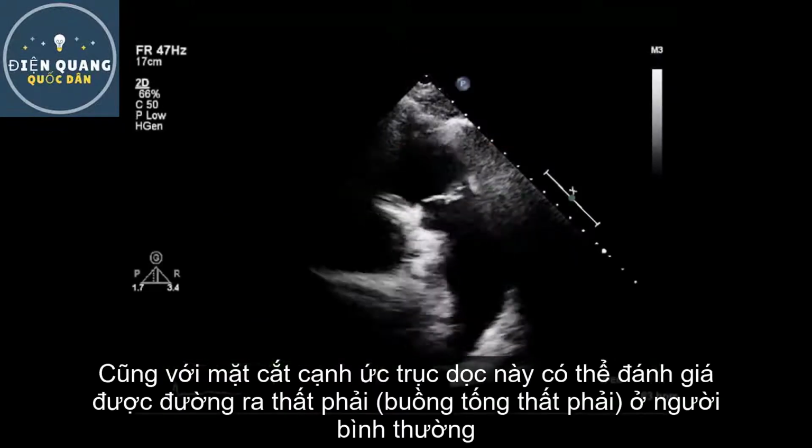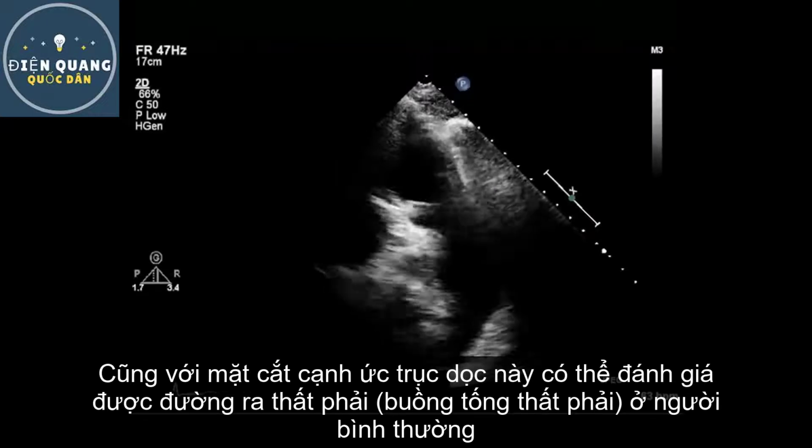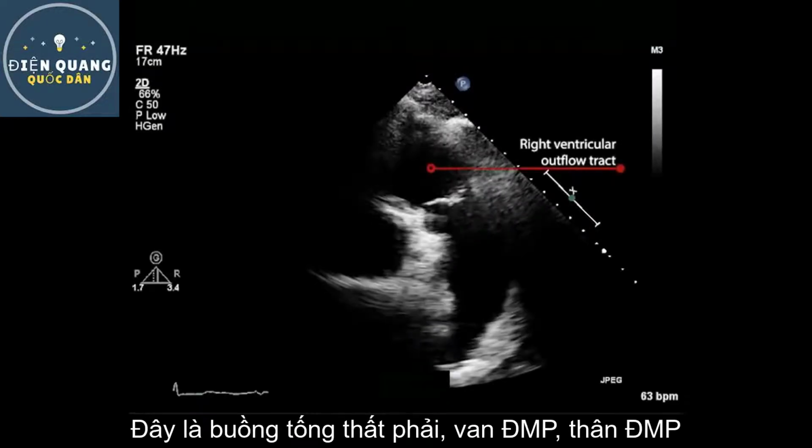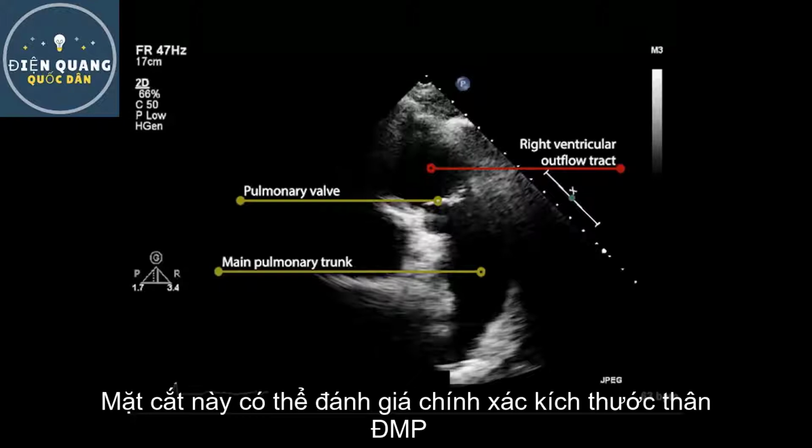From the parasternal long-axis view of the right ventricular outflow tract in a healthy individual, we can see the right ventricular outflow tract, the pulmonary valve, and the main pulmonary trunk. This view can be used to measure pulmonary annular dimension and assess the pulmonary valve.